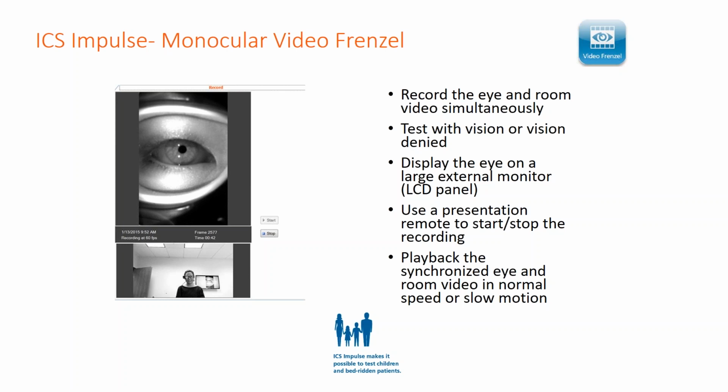But this is a really nice feature that comes built in with the goggle, where you're able to record the eye and the room simultaneously. So this might be nice even for taking a case history, hearing what the patient is saying and being able to play back. We have a feature called DVR where I like to rewind things sometimes if I'm thinking of something else for just a quick second. It's nice to play it back. Now you get to DVR your case history session, or if there's a test in the device that you don't have and you just want to record something, you would be able to do that with this feature.